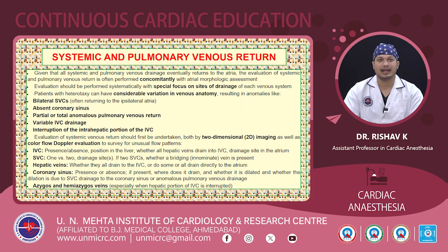So in terms of IVC, what we can see is the presence or absence, the position in the liver, whether all the hepatic veins are draining into IVC, and the drainage site of the atrium. With regard to SVC, whether there is one or two SVCs, what are the drainage sites of the SVCs, and if there are two SVCs, whether there is a bridging innominate vein.